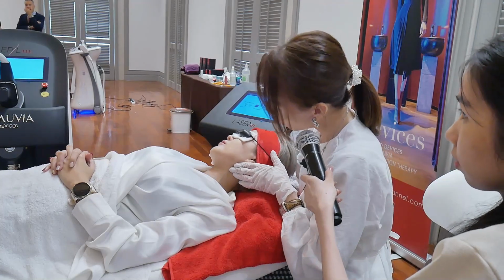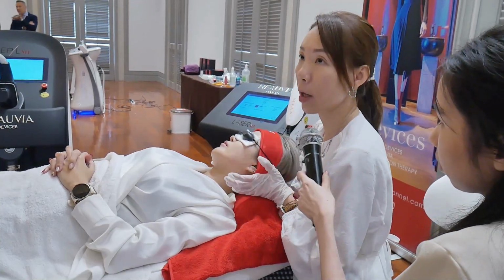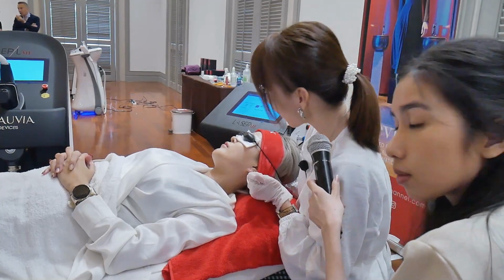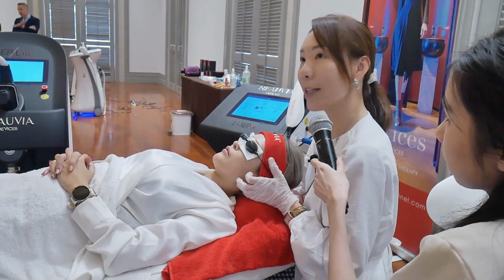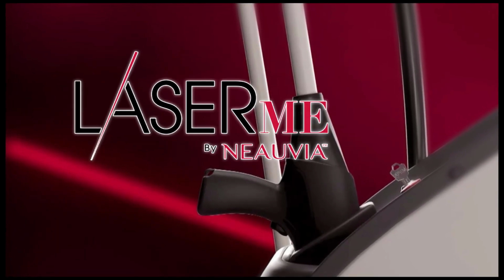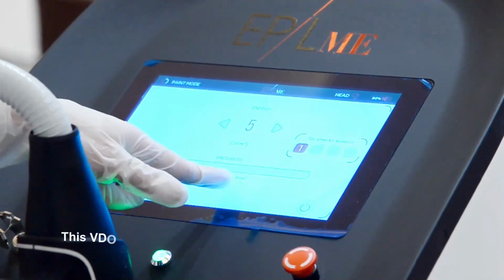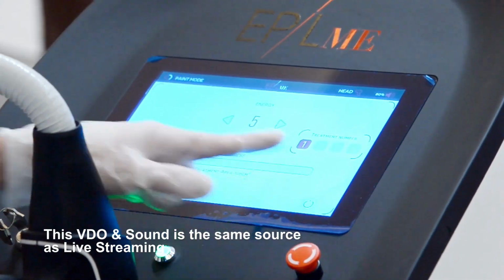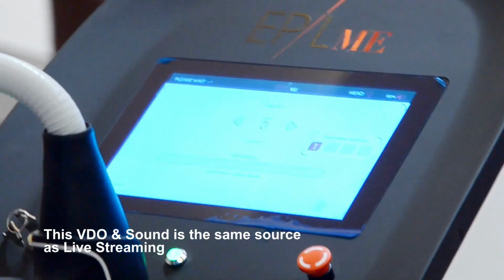Device. Even here, the patient can just immediately go back to the normal mode. Not much of a downtime. Are there any questions here? Actually, this 150 cm is this area that I'm going to treat. Initialize your... Thank you.